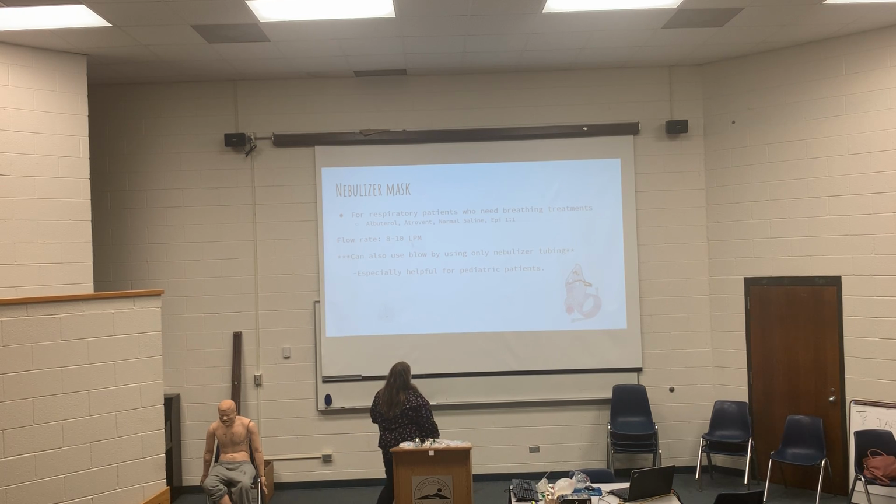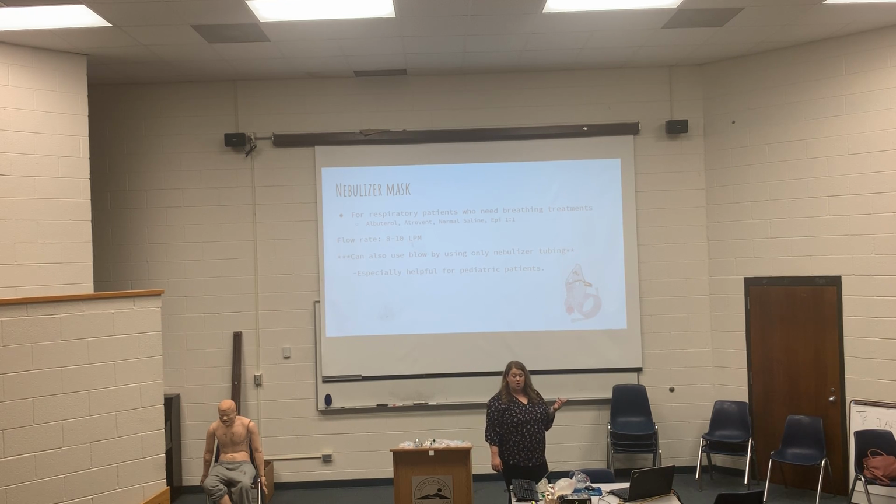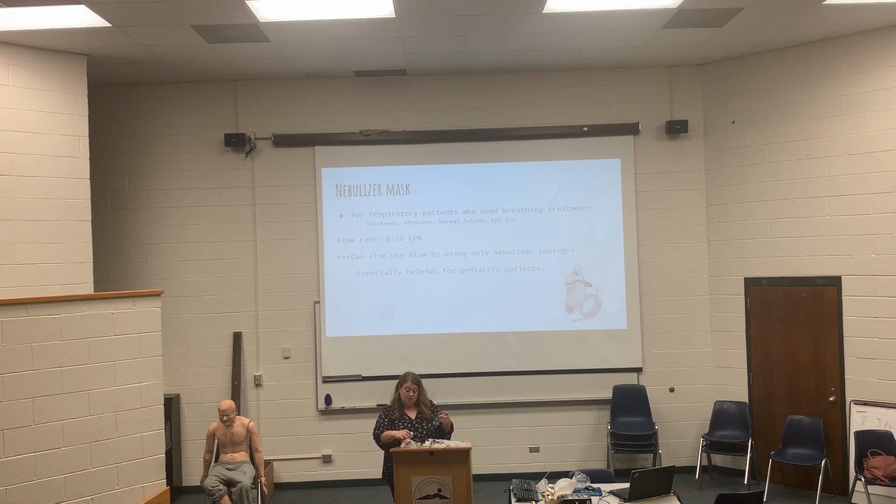So therefore, respiratory patients who need breathing treatments, and our next thing is pharmacology that we're getting into, so we'll really hit hard on that because you guys can give albuterol. But this is a nebulizer setup, and it comes with several pieces. It comes with this T-piece, a mouthpiece, then the medicine reservoir, the mask, and the tubing. So most people, if they're short of breath, I'm gonna give them the mask. If they can tolerate it, it's so much better to give the mask.